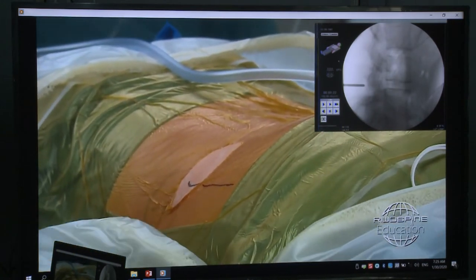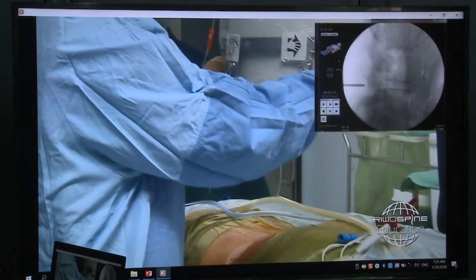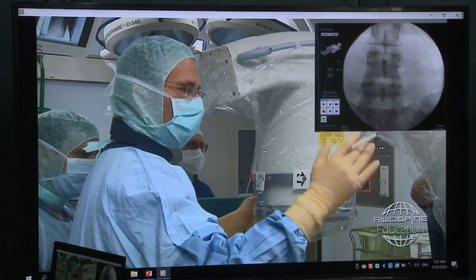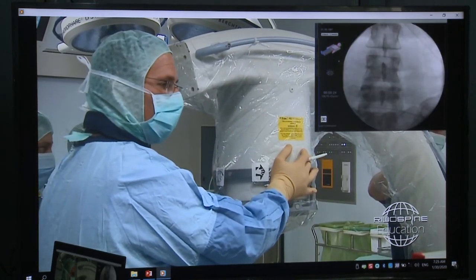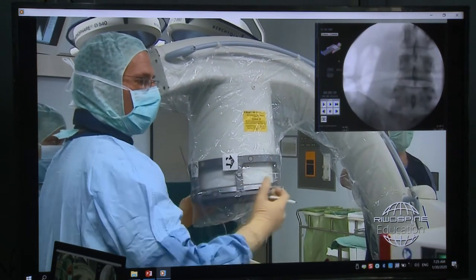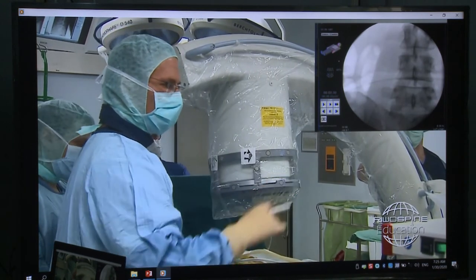And as I told you, we have to have an orthograde view of the level that we want to operate. That means this is the normal view. Then you see the level L3-4 is in the orthograde way. Level L4-5, we have to tilt the C-arm a little bit. When you tilt, you see parallel. Now it is, again, orthograde. You see, I pull the C-arm a little bit to my side to see the iliac crest, but the iliac crest is low enough.